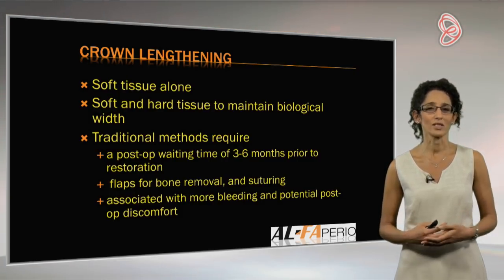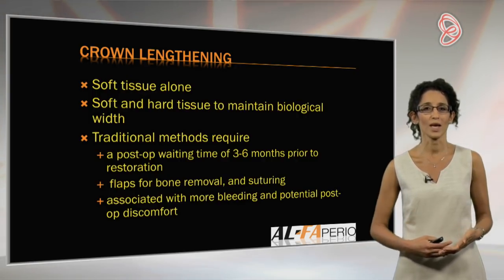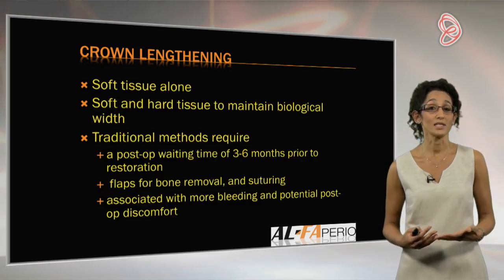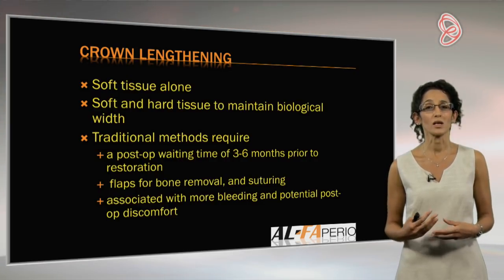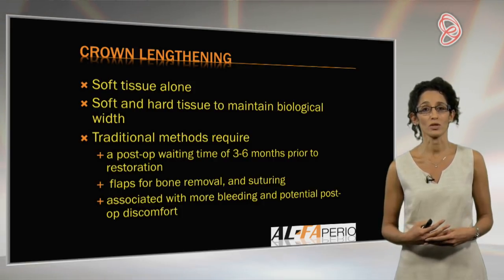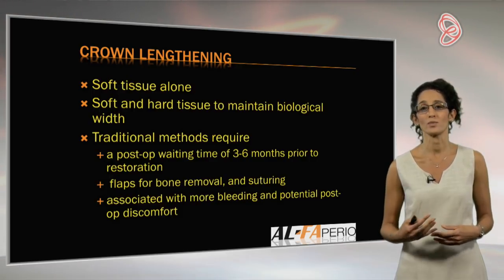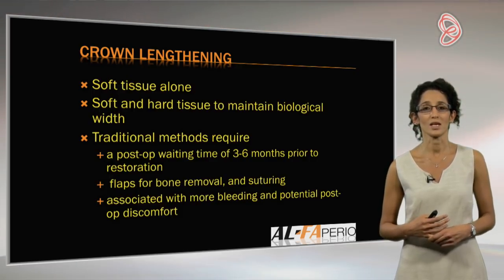I very rarely give antibiotics even with that, but then there is a risk of post-operative pain, swelling, perhaps a little bit more recession. And according to most of the research papers, it does actually take 3 to 6 months for the gingival margins to ultimately settle down. So the longer you can wait before you restore these cosmetic cases, the better.